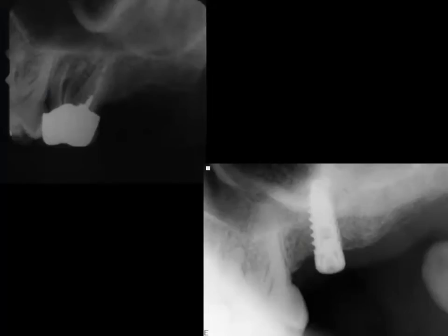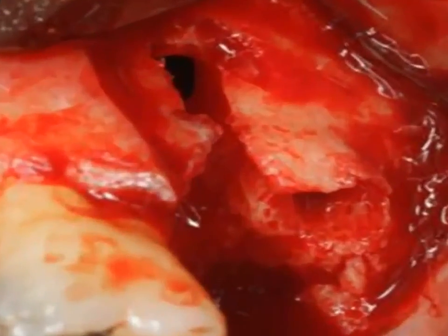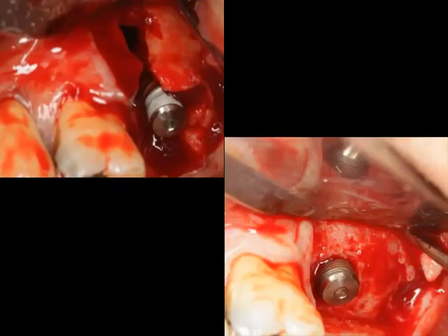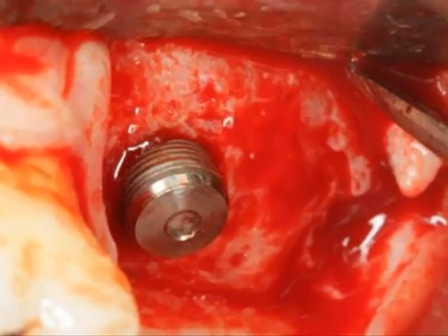Case 5 describes mesial root fracture of tooth number 27. After extraction, we notice a large defect containing perforation of the sinus lining. BONDBOND is used for augmentation during implant placement. BONDBOND is completely replaced by newly formed bone since the material resorption is equivalent to bone formation.